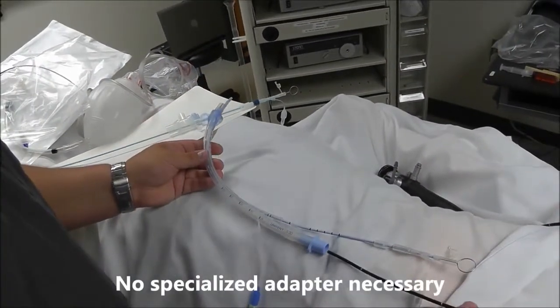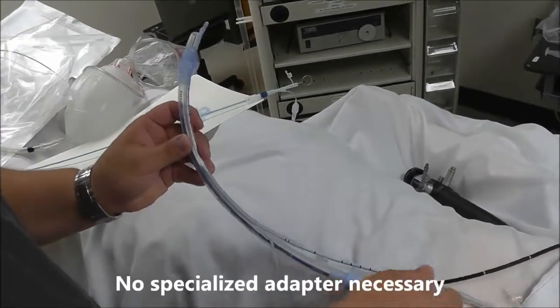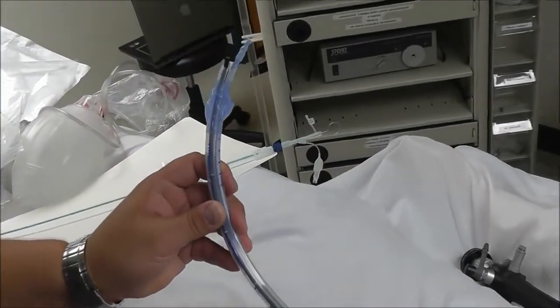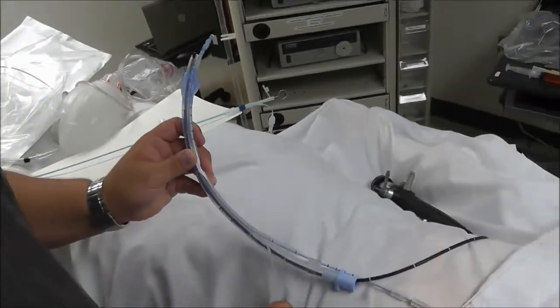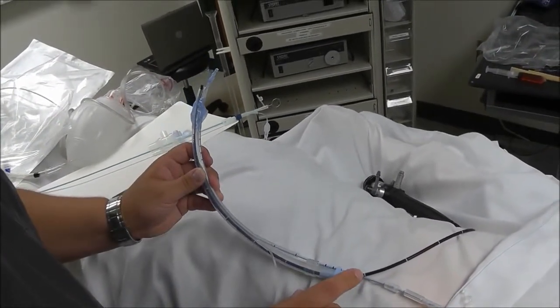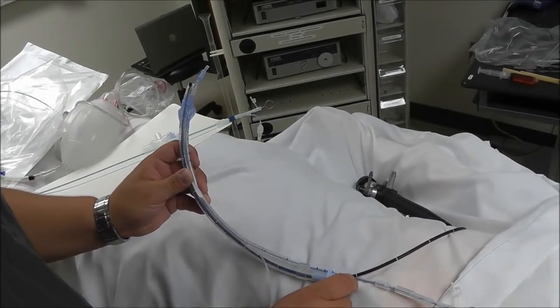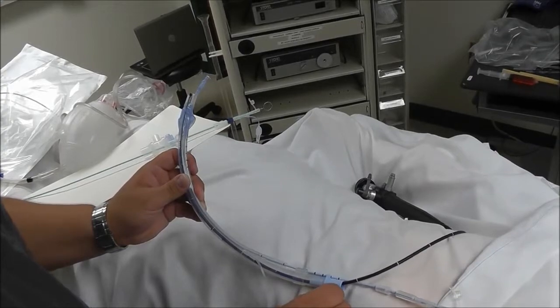Once the tube is in place, you simply pass the scope down the ventilation lumen and advance your bronchial blocker, directing it into either bronchus. One disadvantage to this tube is that while you are placing the blocker and confirming placement of it, you cannot ventilate the patient unless you have the scope taken out.